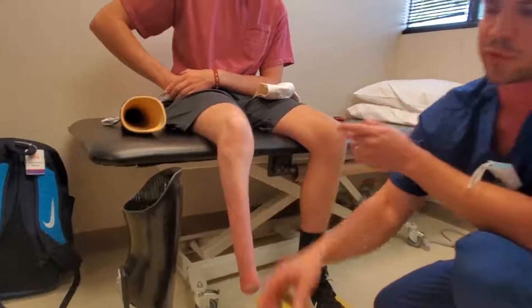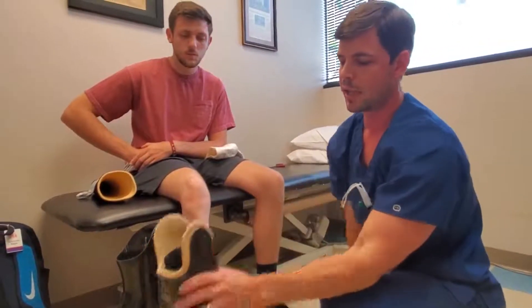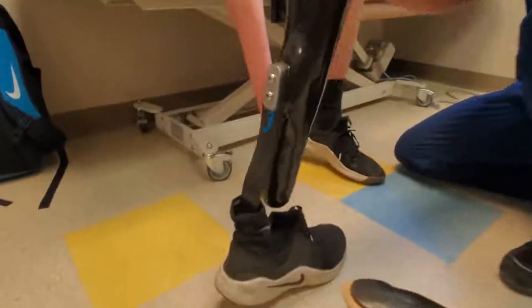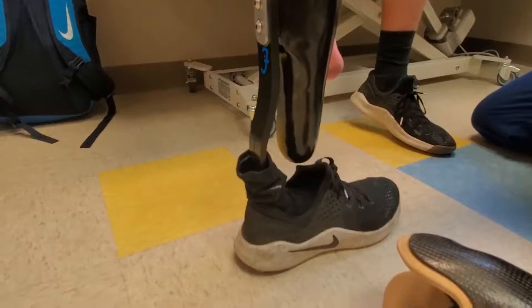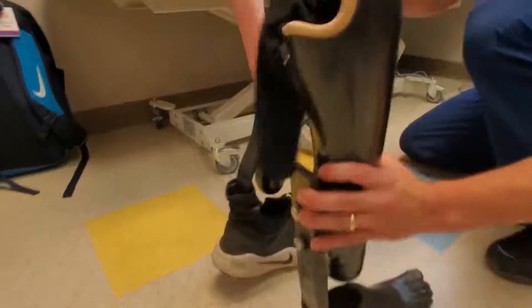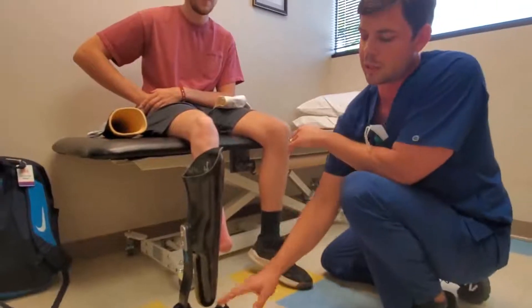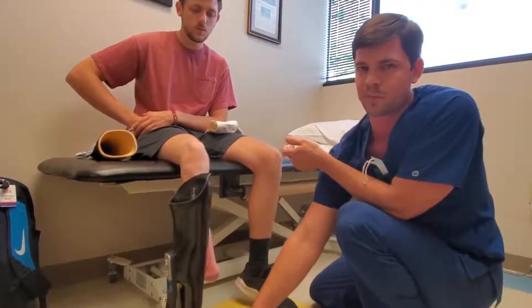The differences between this socket and the new socket are the same design besides the trim lines and the foot. This is a posterior mount All-Pro foot, which offers a little more dynamics and energy return — it's more springy than the old foot. We have more build height and clearance now, and as he's gotten taller and grown, that's why we're able to transition him to this posterior mount foot.